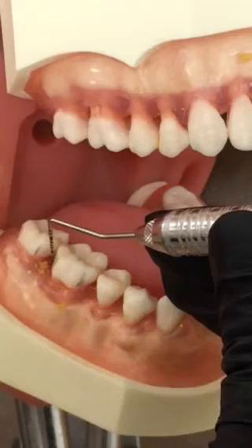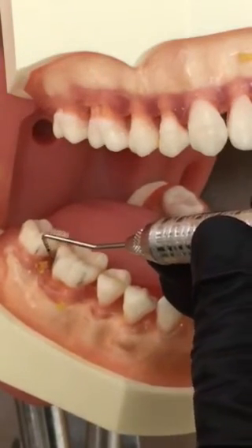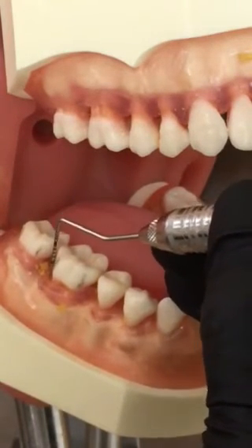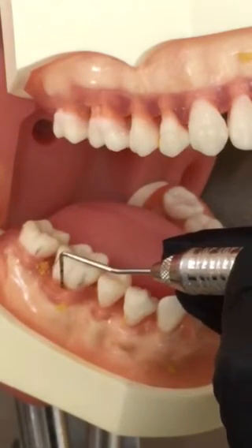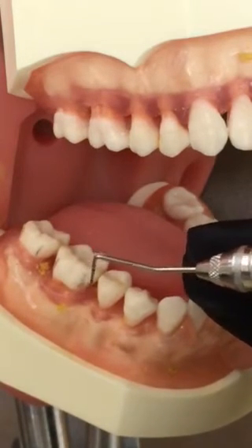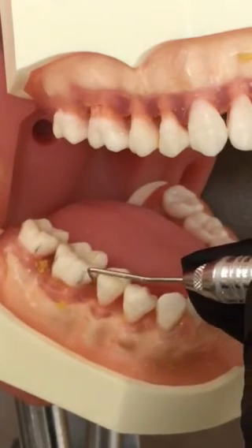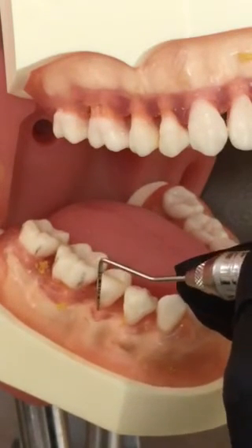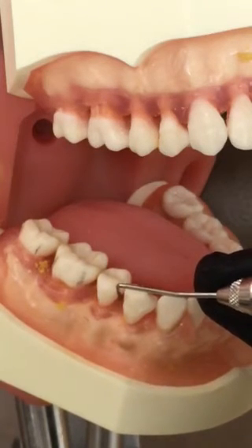I'm going to demonstrate here on number 30, 29, and 28 so you can see. Col mesial, vertical, maintaining parallelism with the long axis of the tooth, gentle probing, around the mesial line angle and then angling again into the col. Then I'm going to remove the probe from the sulcus, re-enter the col area, maintain a parallel walking stroke mesially.